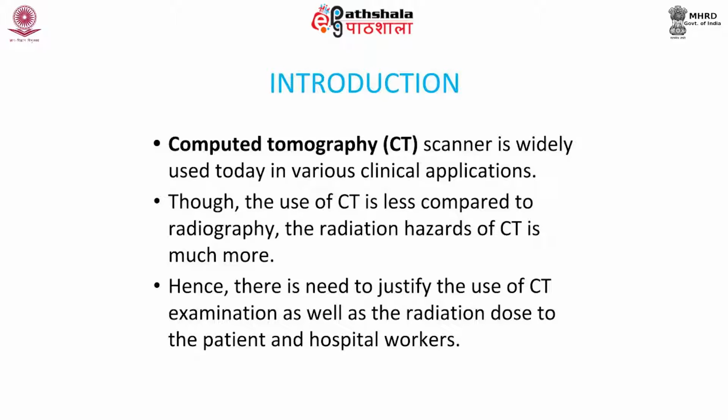Hence, there is a need to justify the use of CT examination as well as the radiation dose to the patient and hospital workers.